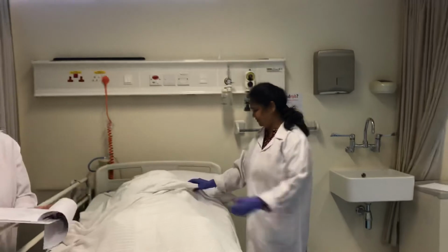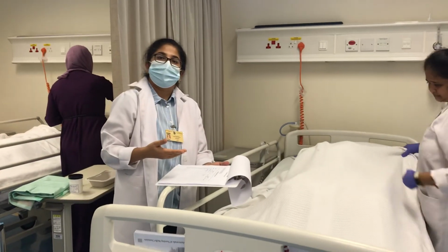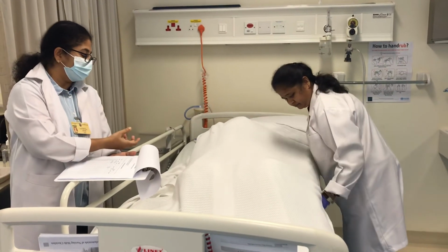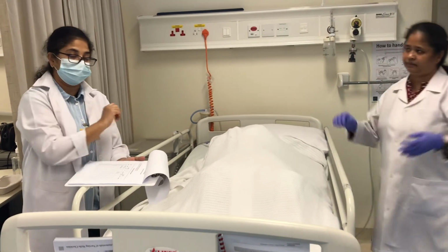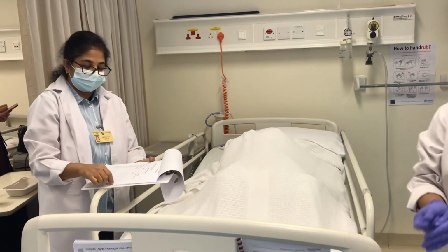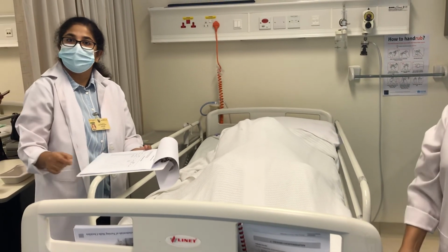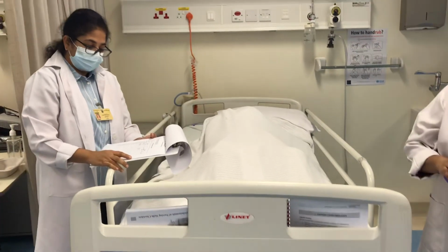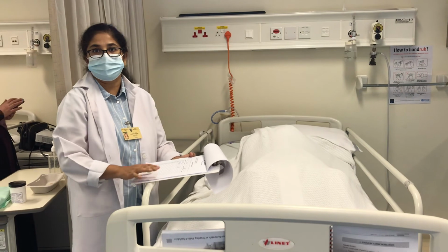And the intake and output we need to maintain. As well as we need to record how much air or normal saline or water for injection we have inserted into that bulb. So that also we have monitored and recorded. And the urine culture and sensitivity, we have sent it. Whatever urine is collected, we will monitor as per the instruction.